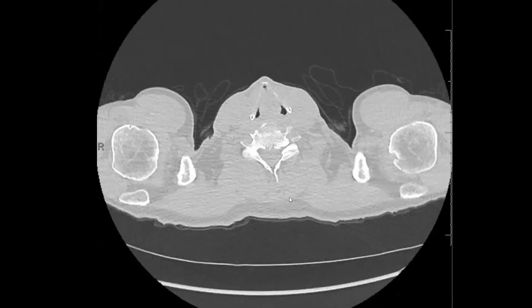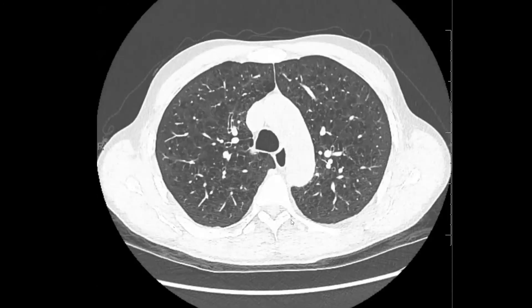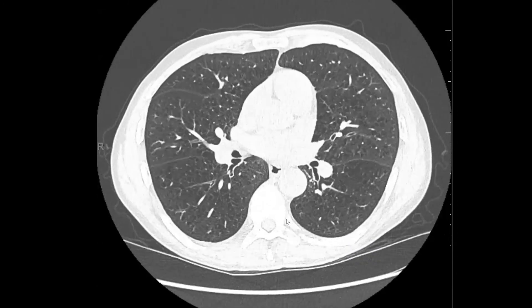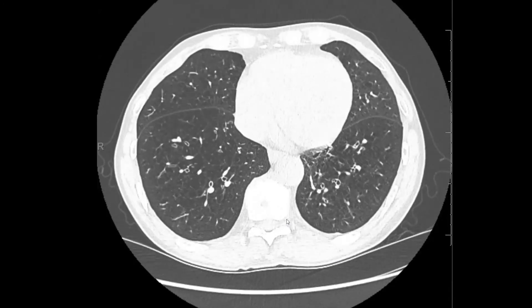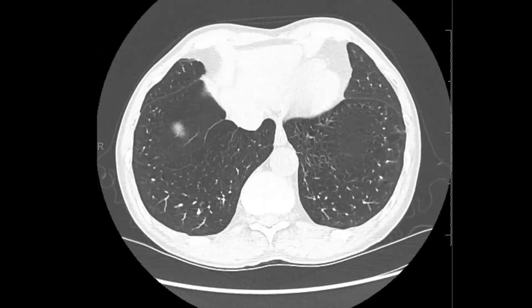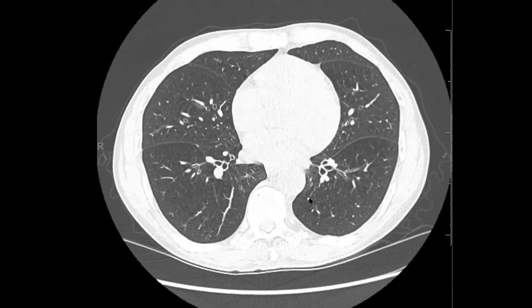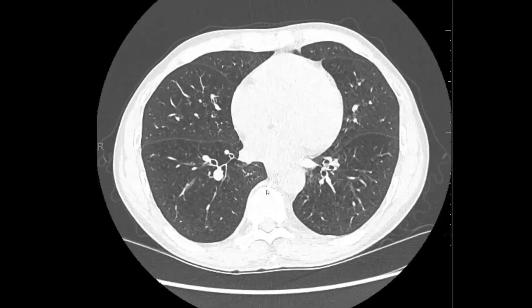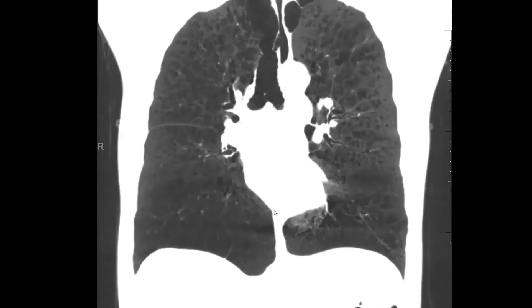Very often in the setting of panlobular emphysema we also see basal predominant subsegmental atelectasis or scarring. We see a little bit of scarring down here but nothing major. When you see basal predominant panlobular emphysema, it's just so much more obvious on the MinIP images.